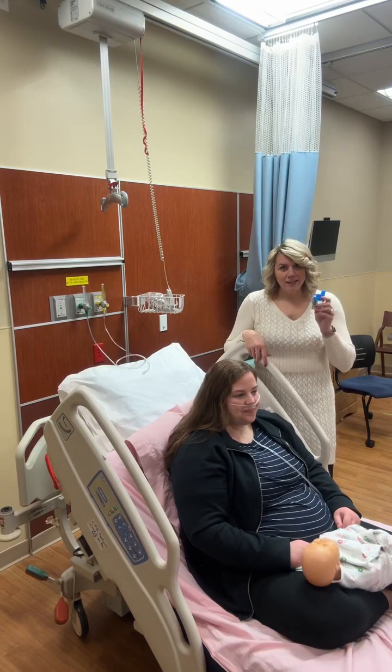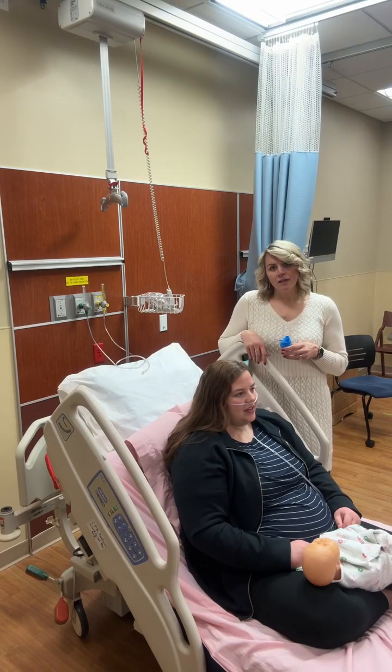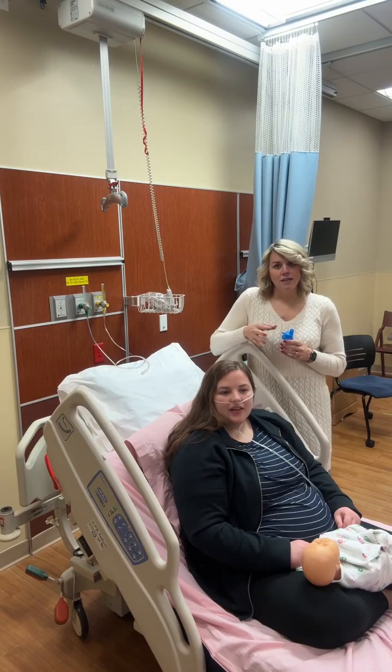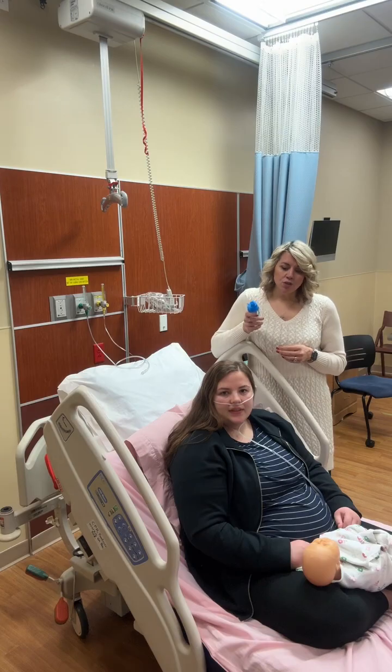Okay, so we are back again. We are talking about administering a nebulizer to a patient who is wearing oxygen. All right, so now we are going to give a nebulizer to Ashley with a mask.